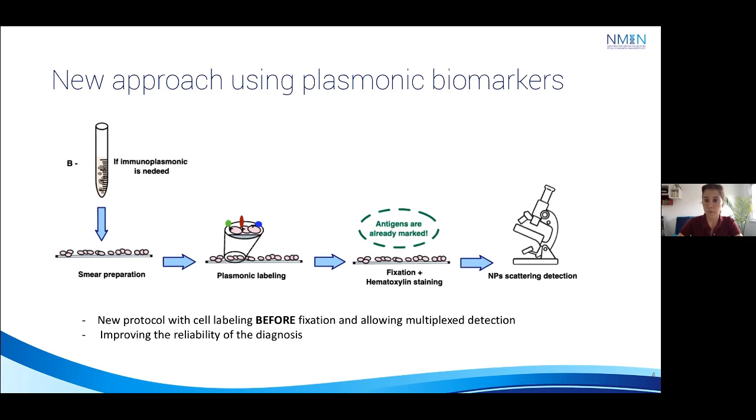And it's to overcome this problem that we want to propose an alternative using colorful nanoparticles to do the labeling of the antigens. The individual nanoparticles will appear as distinct colorful dots in the samples, which will allow both multiplexing and quantitativity. Another advantage is that the labeling could be done in one single slide for multiple detection. And also the labeling would be done before fixation.